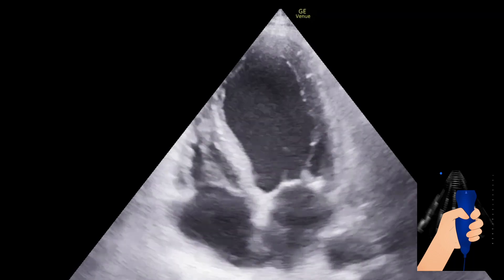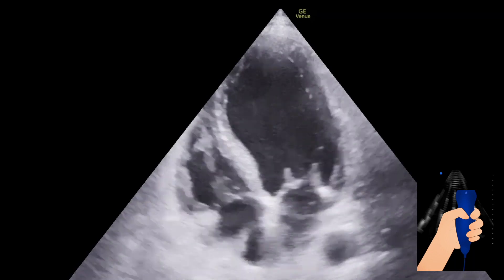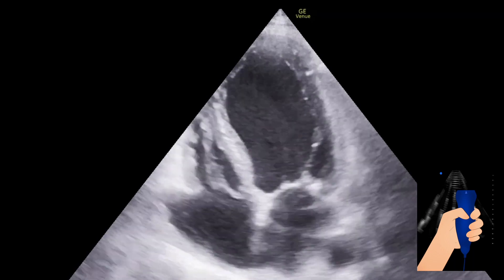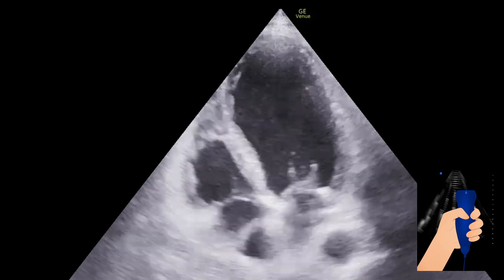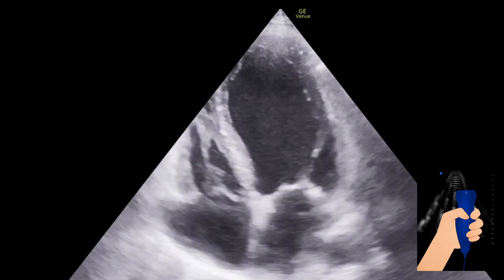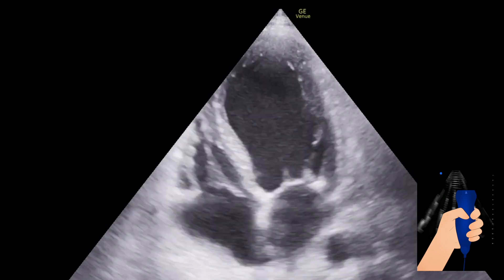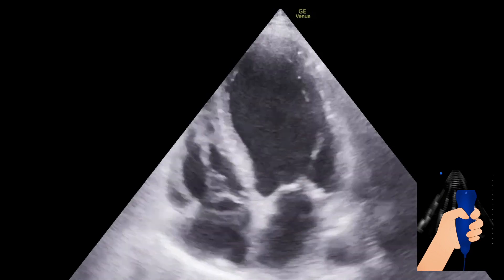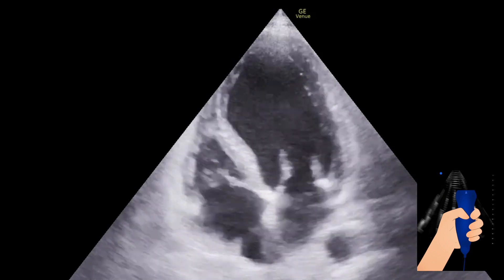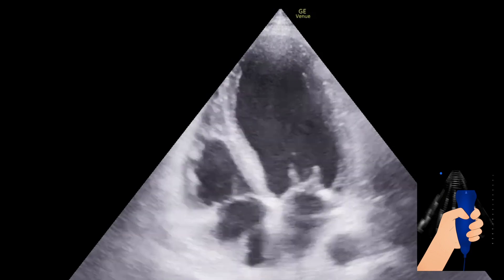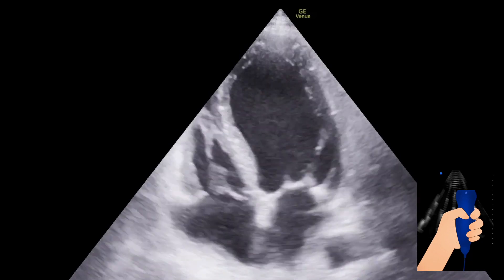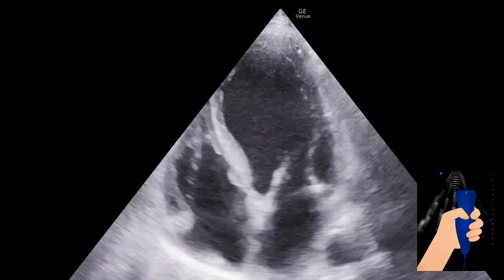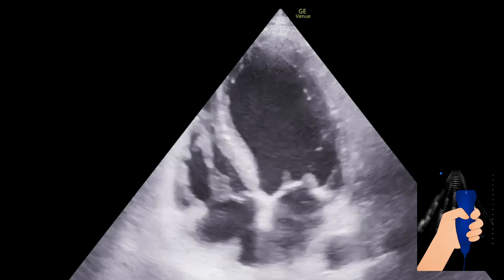This is another view from the same patient with a little bit more gain — as you can see, it's a little bit brighter. The idea of making it brighter is for you to see the flow and spontaneous contrast noted in the left ventricle every time the mitral valve opens.